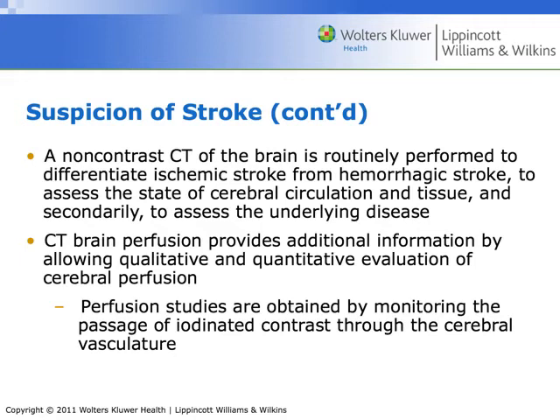These studies are the ones that Cedars-Sinai made so famous, because they had their CT machines set to too high of a technique for the CT perfusion studies, because you're scanning the same place over and over again, and it's just above the eyes. And they had patients who were losing hair due to CT brain perfusion studies. So people are a little bit hesitant to order this study.